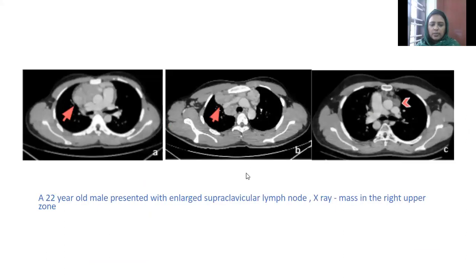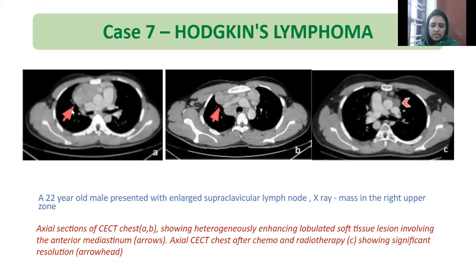A 22-year-old male presented with enlarged supraclavicular lymph nodes. X-ray showing mass in the right upper zone. CT showing heterogeneously enhancing lobulated soft tissue lesion involving the anterior mediastinum. A follow-up image taken after chemo under radiotherapy is showing significant resolution. Biopsy revealed Hodgkin's lymphoma.